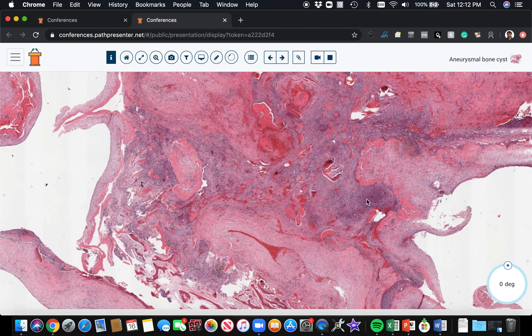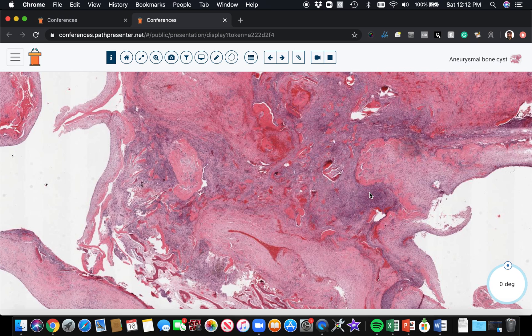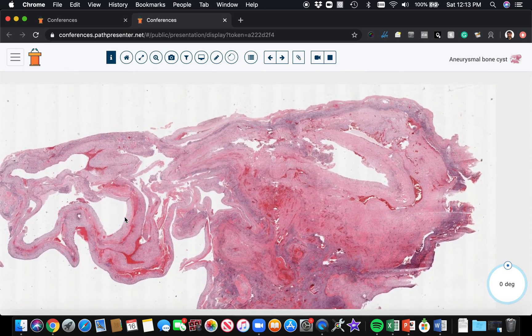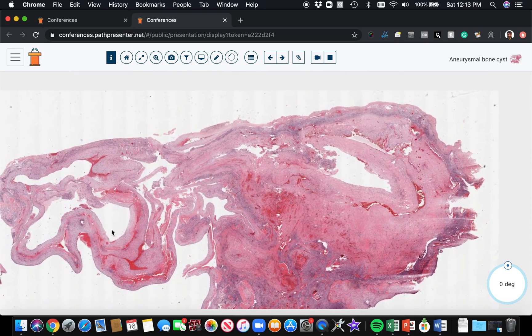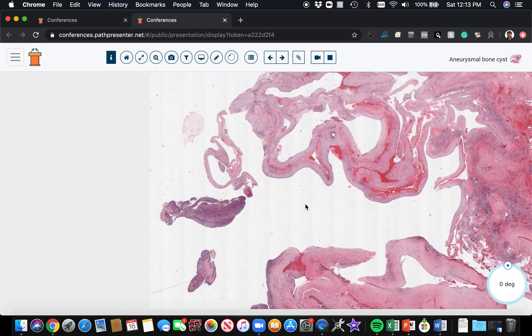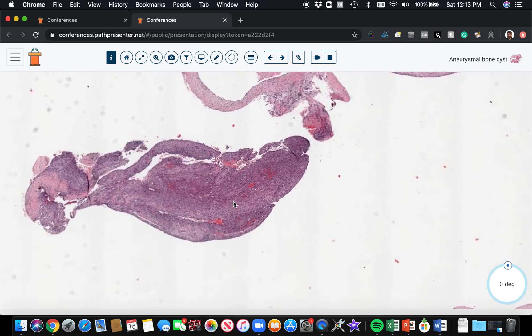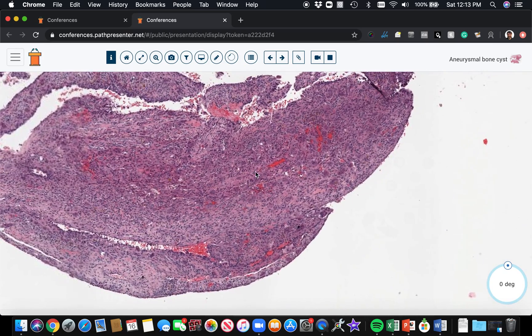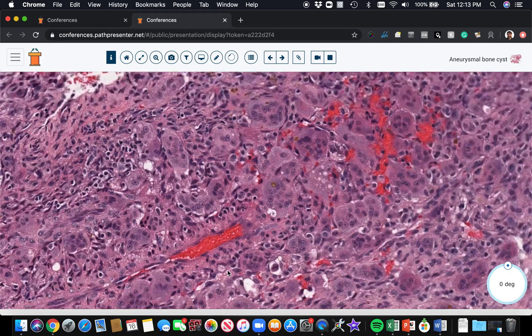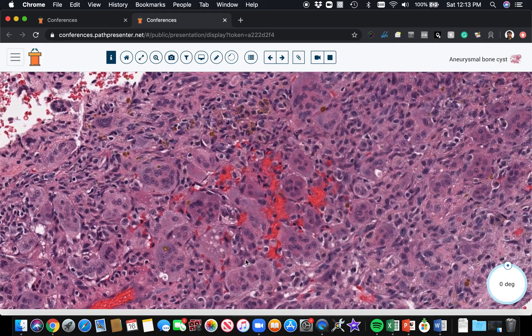And septal lining for blood-filled spaces with only a few pockets of giant cells. So this is aneurysmal bone cyst. If the majority of the lesion is sheets of giant cells and then you have some little pockets of blood, then that would be better for a giant cell tumor of bone with secondary aneurysmal bone cyst formation.